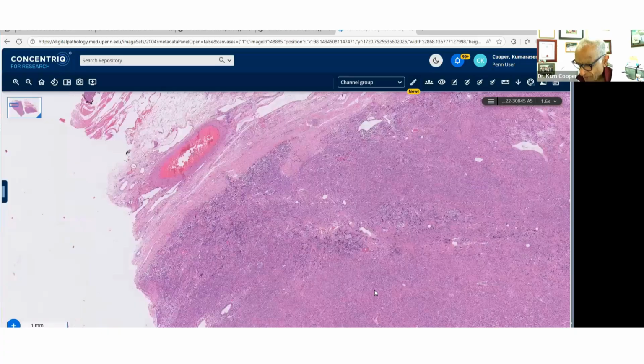Okay, so we've got some pretty decent markers cooking here. I'm going to cut down to the chase. Okay, so desmin is diffusely positive, and the GIST markers are negative. CD34 is negative, and obviously we threw in STAT6, so that's negative. Got that out of the way. But both SMA and desmin are diffusely positive. HMB45 is negative. We did not, beg your pardon, do anything for synovial sarcoma.